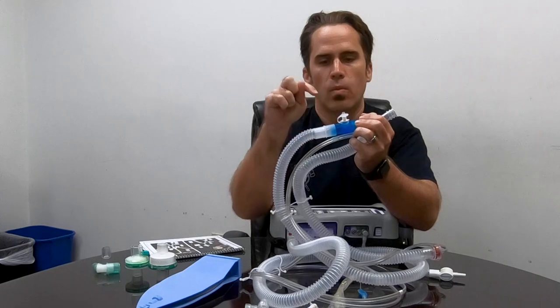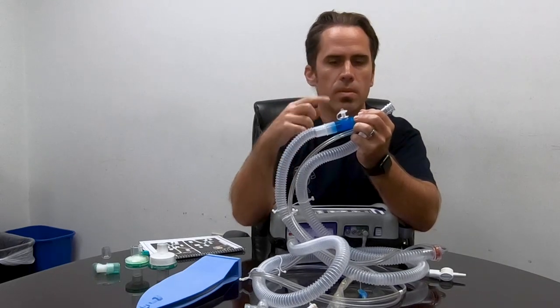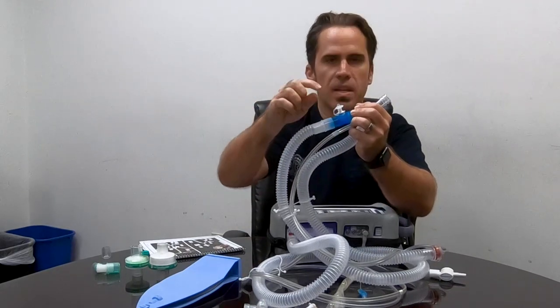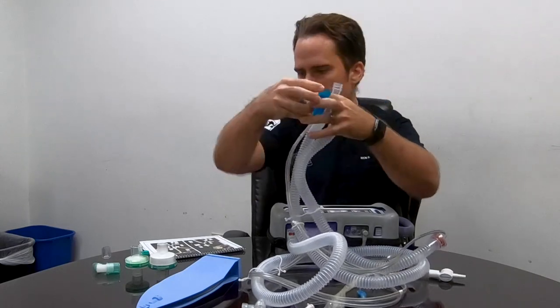We don't need to put the MDI adapter on every single patient — only on patients where we want to give a little bit more to open up their lungs. So we usually have this off.